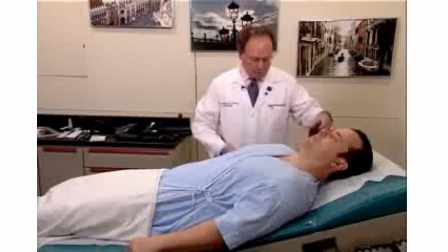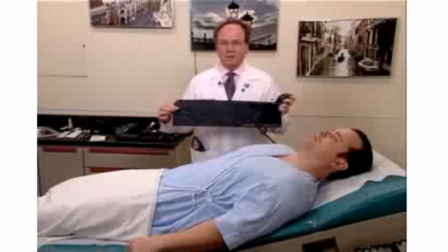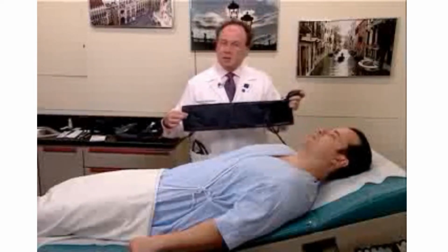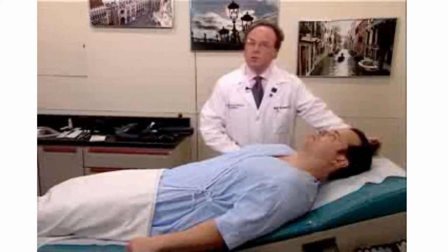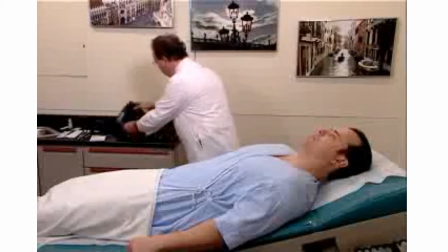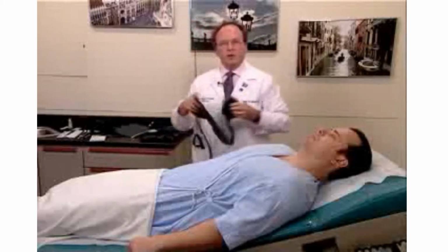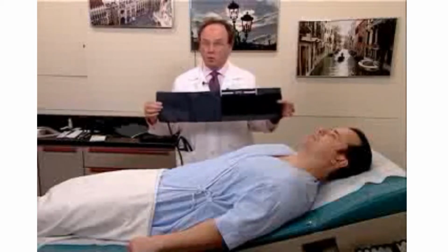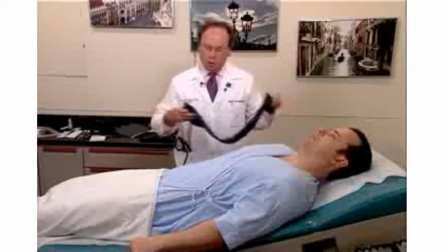This is a standard adult cuff, and this is the type of cuff which you usually will have in examination rooms. There are three other cuffs. This is the large adult cuff, and this is used on the arms of patients who are obese or happen to have very large arms.